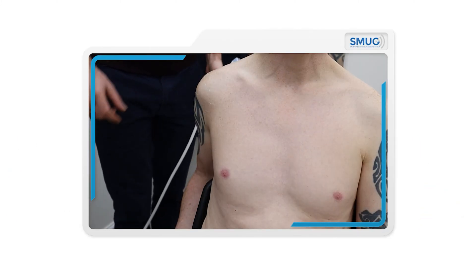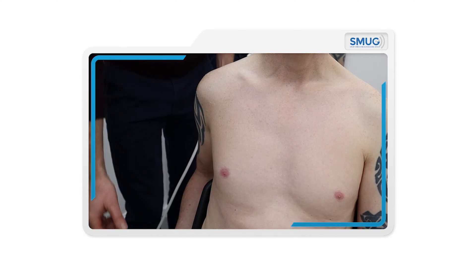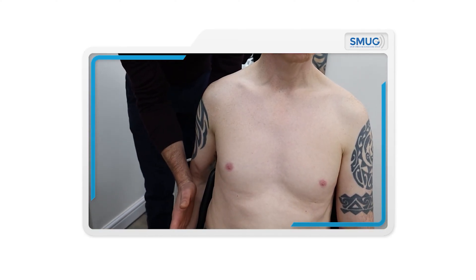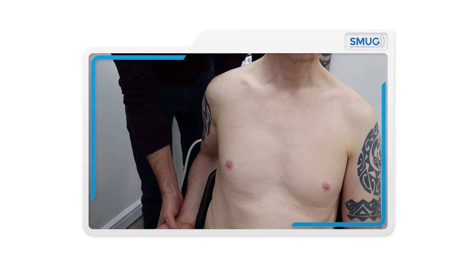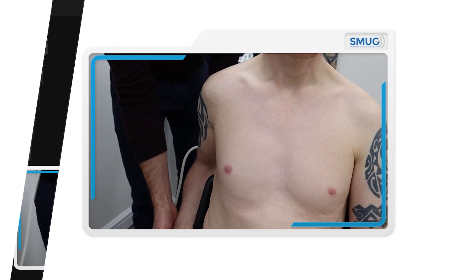To scan supraspinatus, it's very important to get the patient position correct. We don't use the crass or semi-crass position. We just need to make sure that the forearm is neutral so the hand isn't on the leg, and we bring the elbow into as much extension as you require to ensure that you can see enough of supraspinatus.